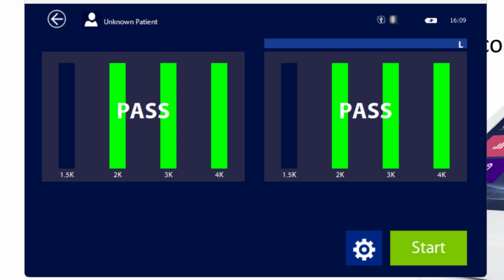But the idea is of course clear. If it was on a patient, I need to retest my right ear again just to have the correct data. Or if it was a pass already, maybe I don't care. A pass is a pass. Okay, that's the screening test.